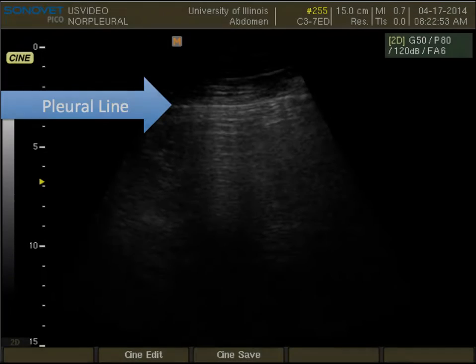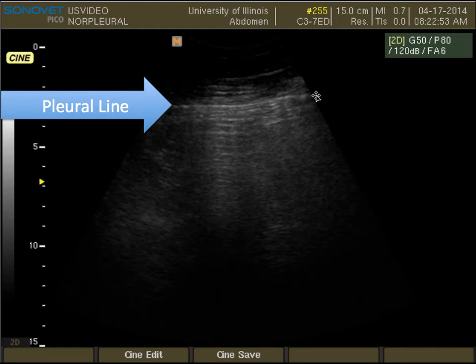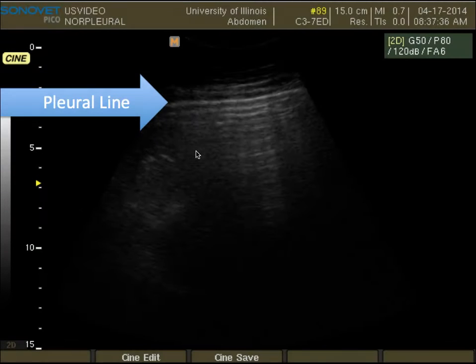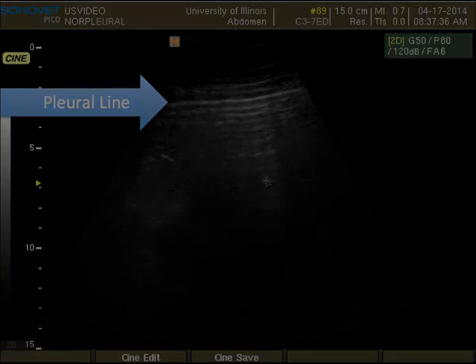This is the second normal lung ultrasound image. As you can see, here is our pleural line quite nicely, and our normal lung parenchyma below. This is the third normal lung ultrasound image, and once again you see that nice pleural line with the normal lung below.